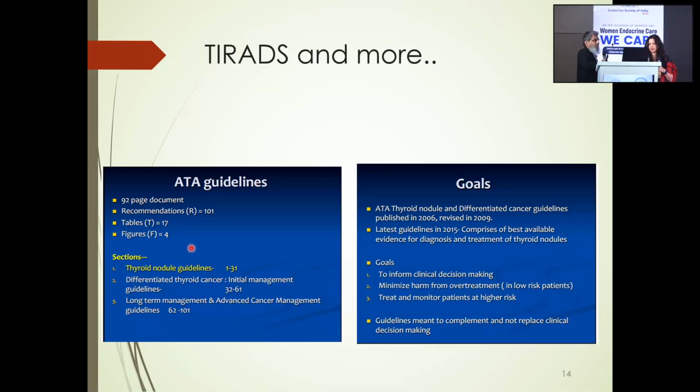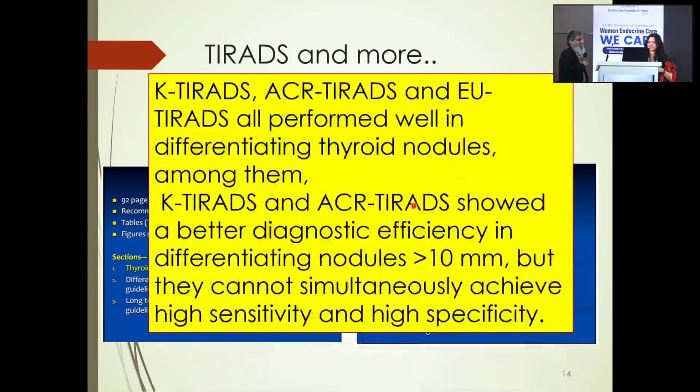That is all available. Basically, these are little coarser guidelines, so the surgeons use it more. They want something very simple. They don't want to complicate it, so they tend to use this more. Absolutely. So this we have already discussed. I think we can move ahead.